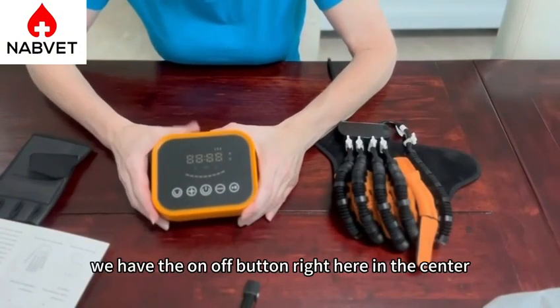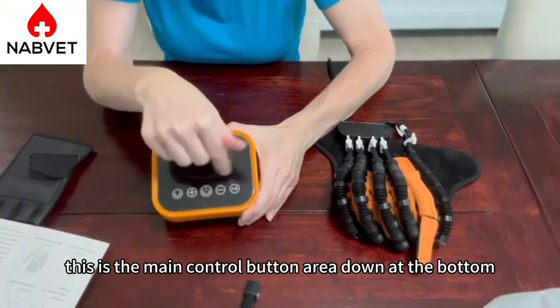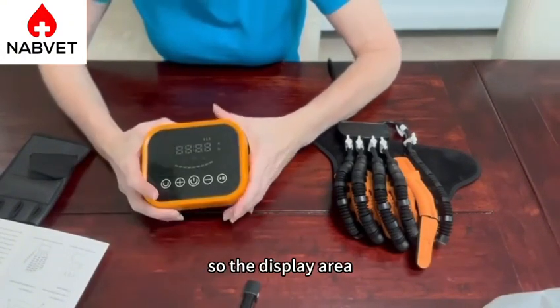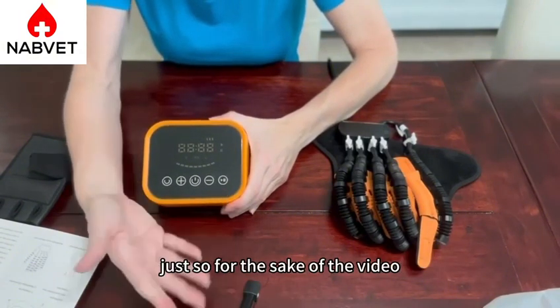Let's go through what the host is. We have the on-off button right here in the center. This is the main control button area down at the bottom. Here's our display area. There's a charging port right here, and then that's the rehabilitation glove interface. The first thing I'm going to do is just turn it on, and then I'm going to put it on pause just so for the sake of the video we don't hear it running.